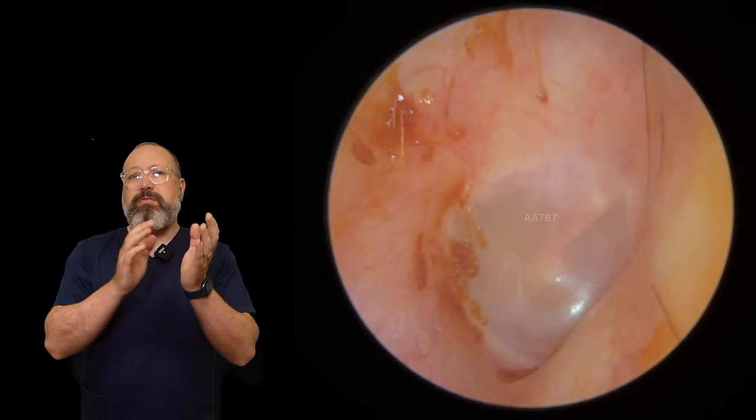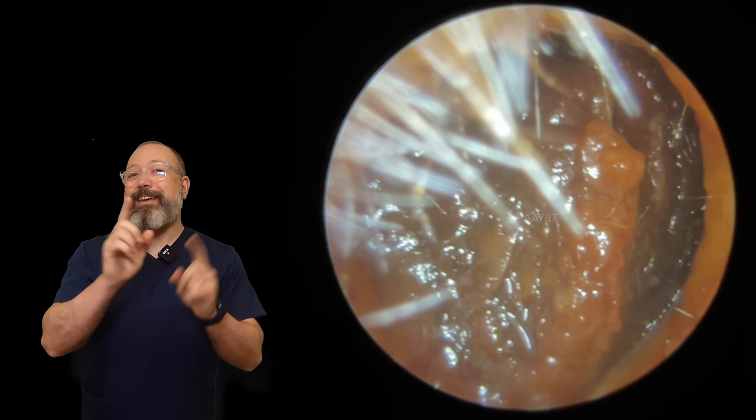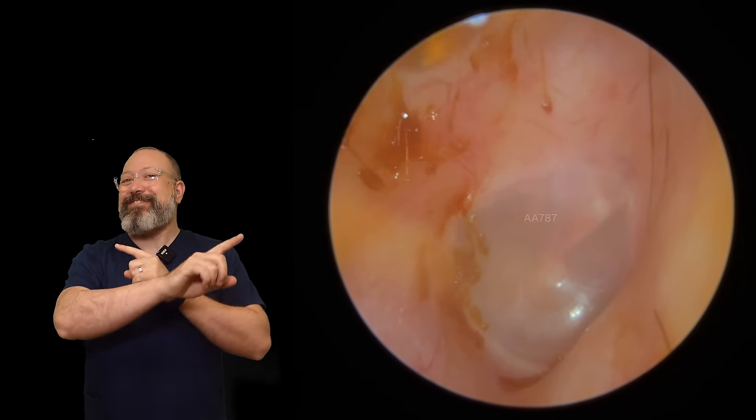The other ear canal has a very mushy, wet wax all over the eardrum and that's really difficult to do with suction. This is what it looked like before — and this is what it looks like afterwards.